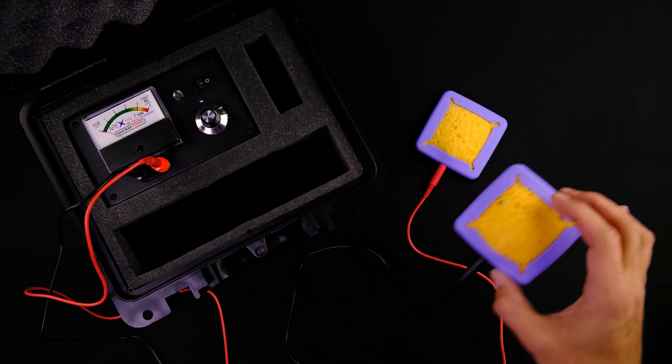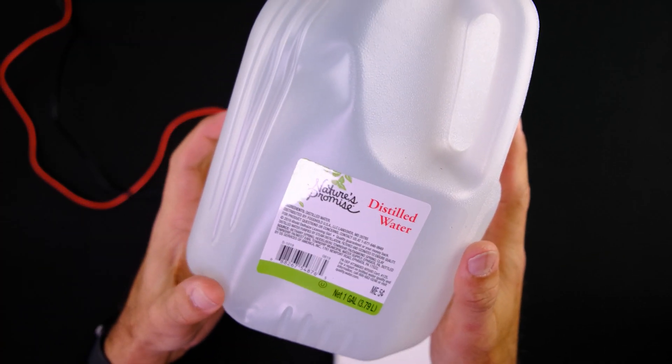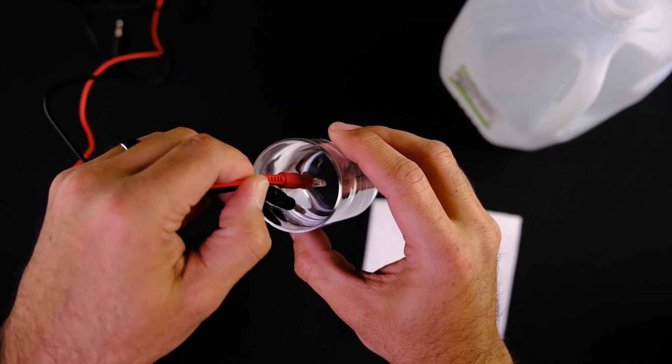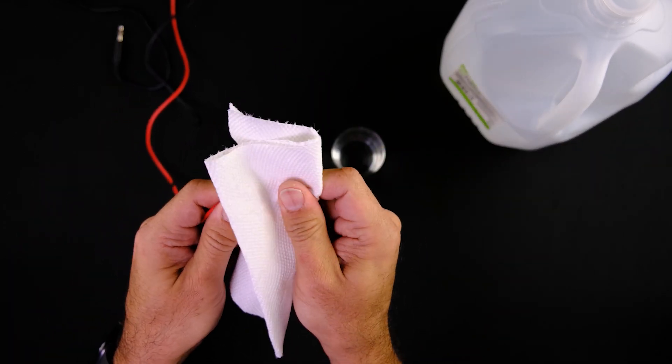Immediately upon finishing your session, remove the cables from the device and the electrosquare electrodes. Rinse the ends that were inside the pads, ideally with distilled water but any fresh water will work, and then dry them gently. Although the cables will corrode over time due to being exposed to salt, you can make them last at least six months if you follow this step every time.